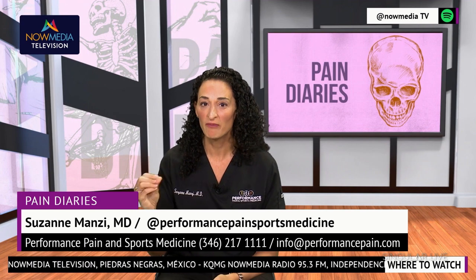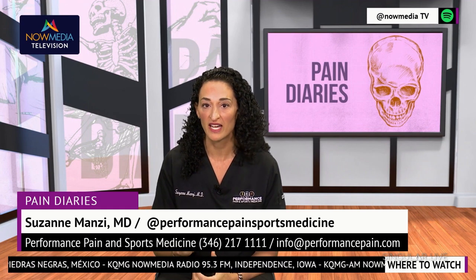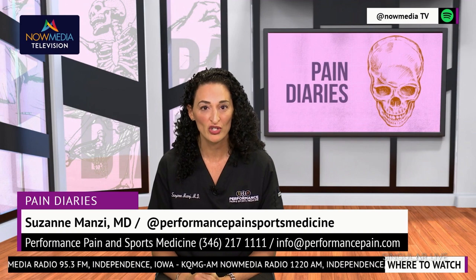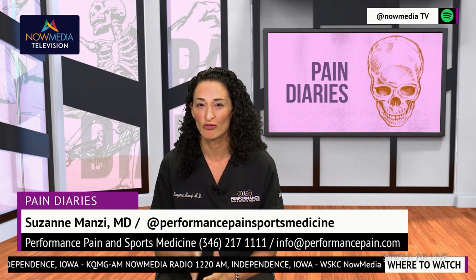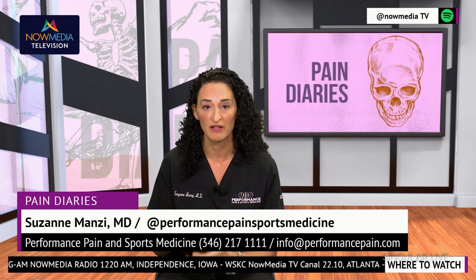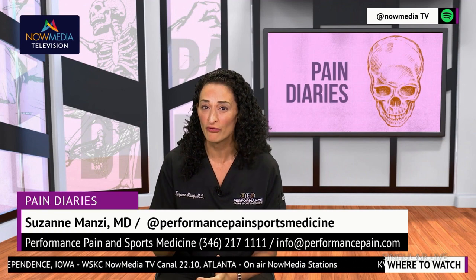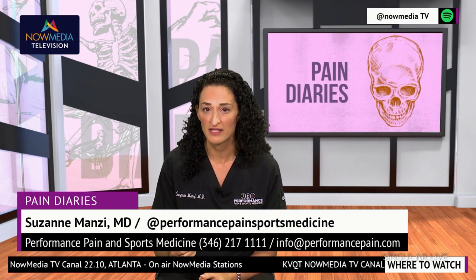Treatment does not involve medication but electricity that is dosed and has minimal side effects, making it safe and effective as an alternative to those who cannot tolerate or do not respond to traditional pain treatments. Additionally, spinal cord stimulation is reversible, which means it can actually be removed at any time if you no longer need it. Spinal cord stimulation is promising, and it's been around for a long time now, but this is great for options for chronic pain sufferers.